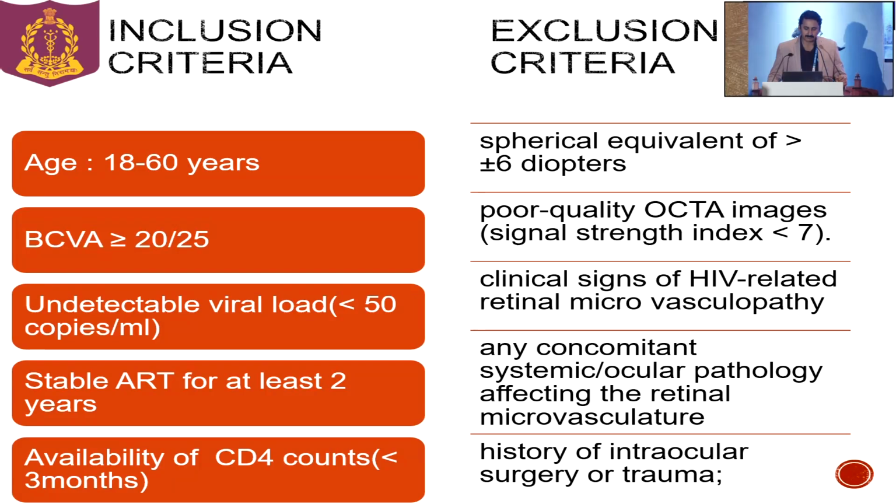of spherical equivalent of more than plus or minus 6 diopters, poor quality OCTA images, and clinical signs of HIV-related retinal microvasculopathy or any concomitant systemic or ocular pathology affecting the retinal microvasculature, or any history of intraocular surgery or trauma.